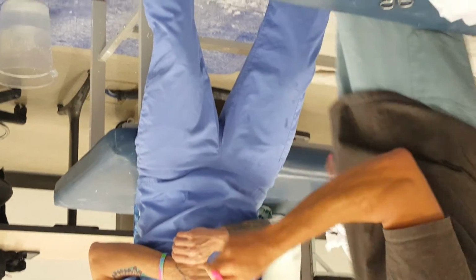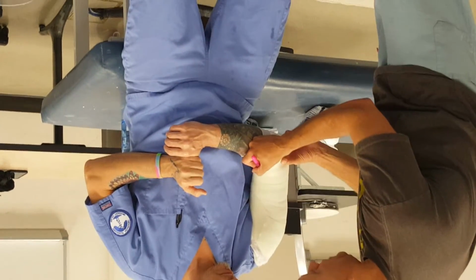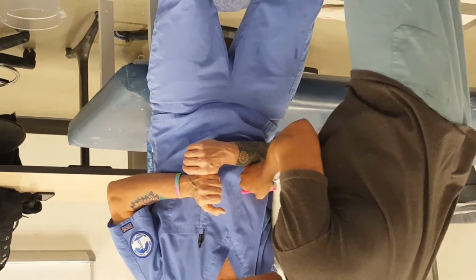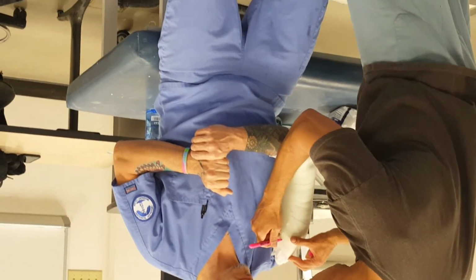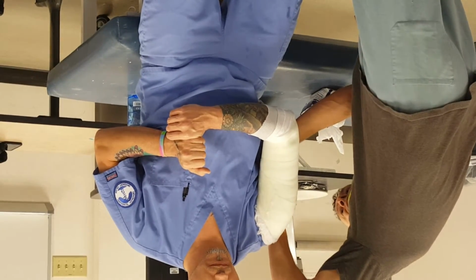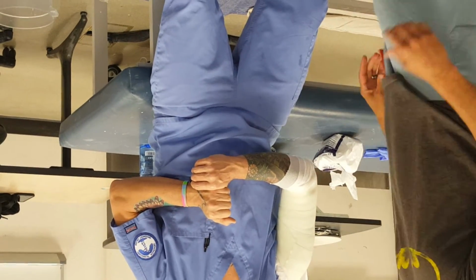The biggest problem with this cast is if I draw it way up high, it slides down more. This cast likes to slide down, just like a cylinder. So the higher I go up here, the more it's going to slide down. I didn't move him at all. He stayed in the same position while I drew that. You guys don't like to change positions. Now it's so thin I might be able to just cut it out with a pair of scissors, but I'm going to use a saw instead.